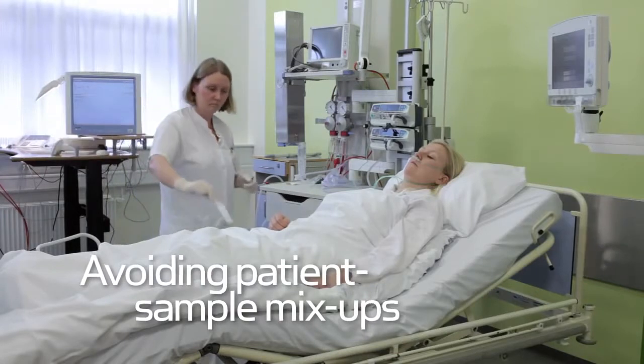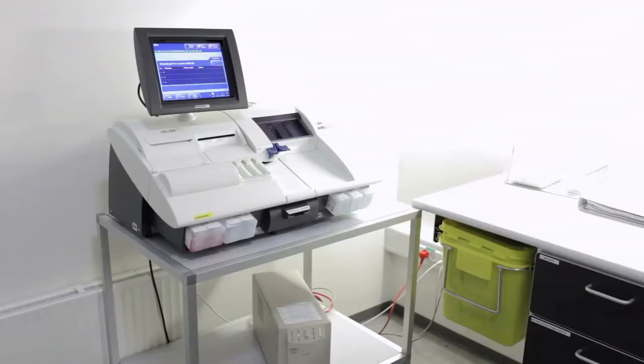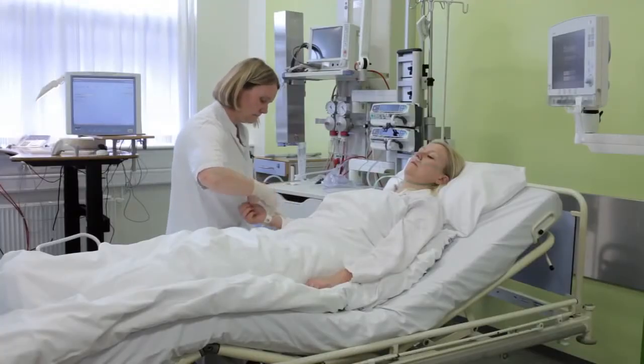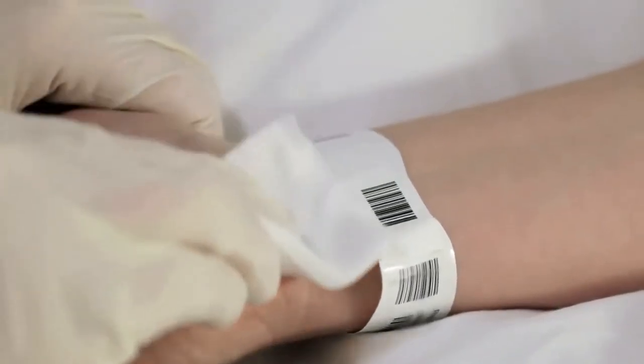The information is automatically transferred to the analyzer. You prepare the safe PICO sampler and draw a blood gas sample.